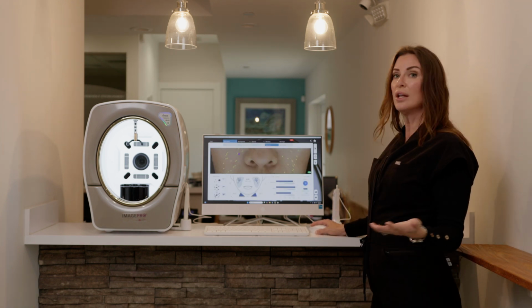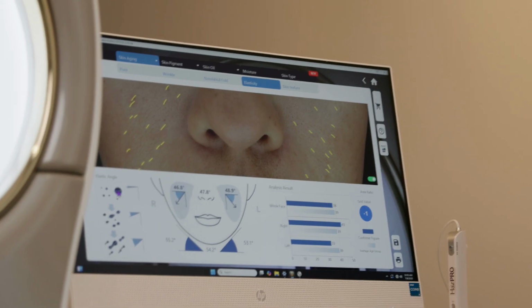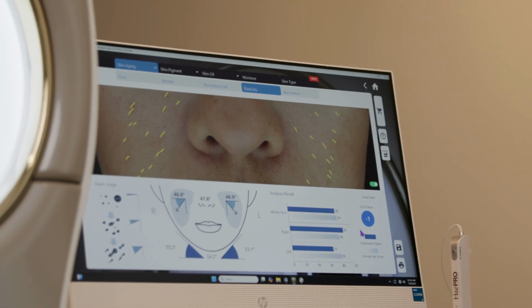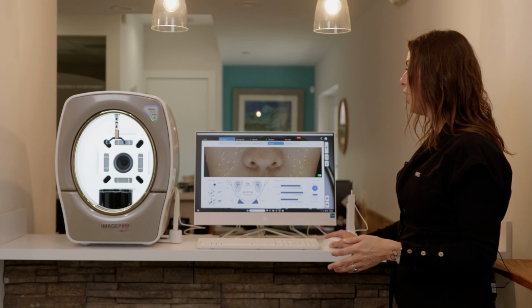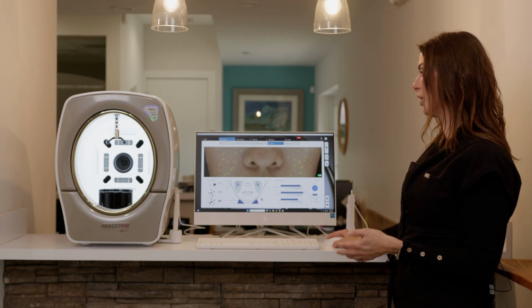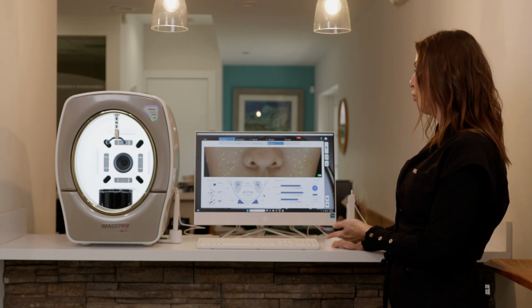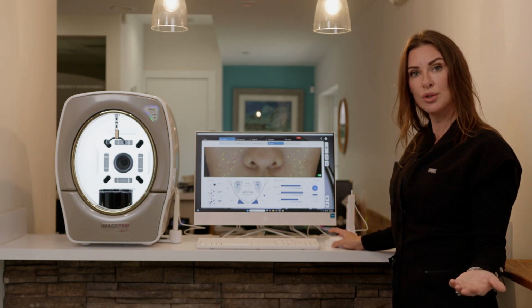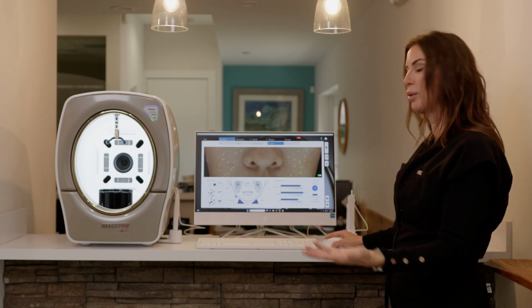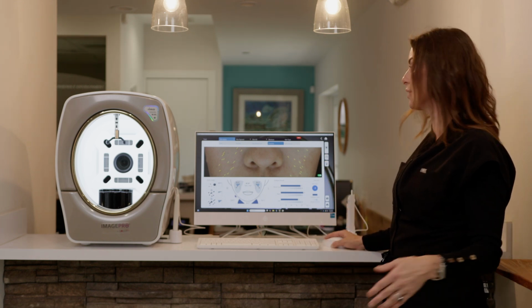Elasticity. These little yellow lines are actually not just little yellow lines. It's based on the angle and outlined here. So she's 1 better off than those of her average age group. She's done amazing with her skin. But this here too is an opportunity where, you know, you see a little bit of a void over here on the left side. If we were going to do facial symmetry or jaw filling, we would fill more on the left side. So your opportunity as a practitioner to say, we probably need 1 syringe here, you know, 3/4 of a syringe over here. Now we've moved her into upwards of 3 syringes.